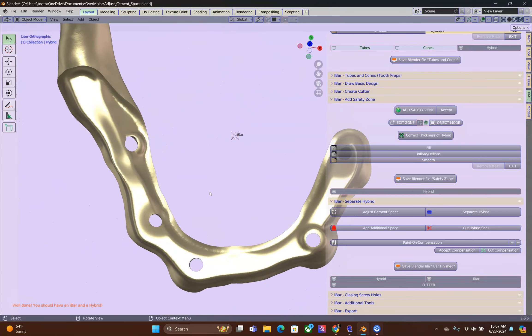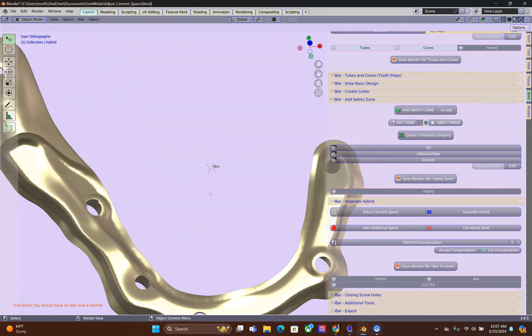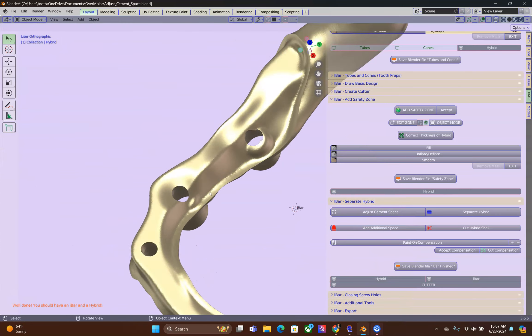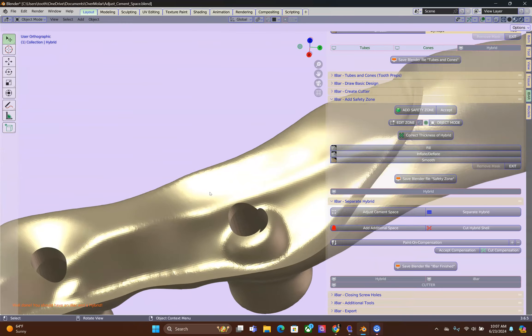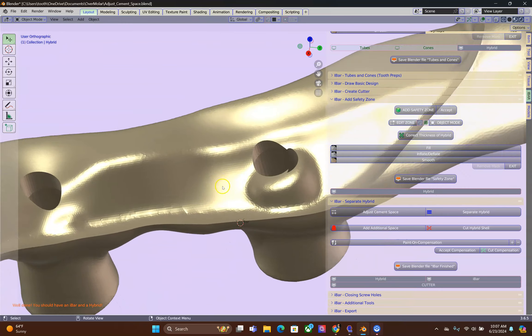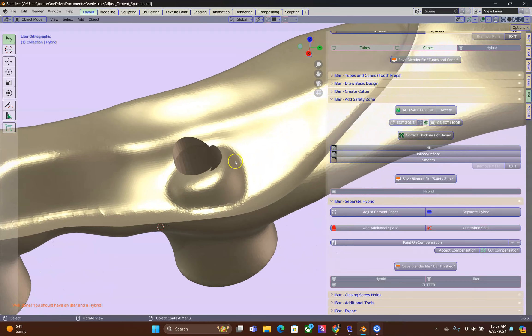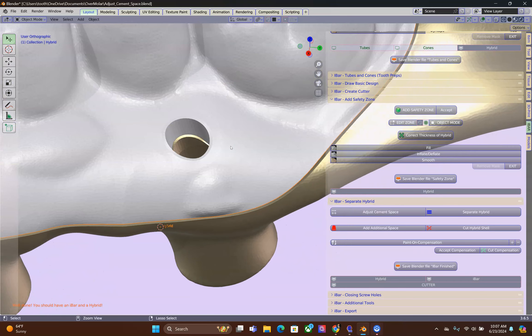Now, a brief inspection shows me that I am not happy with this screw hole over here. This is why I am going to go back a few steps.